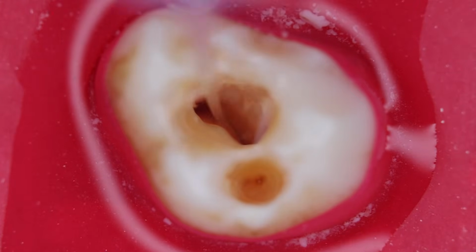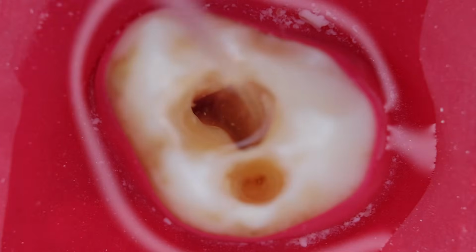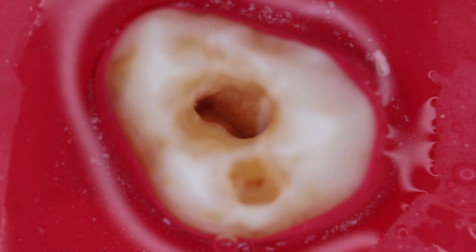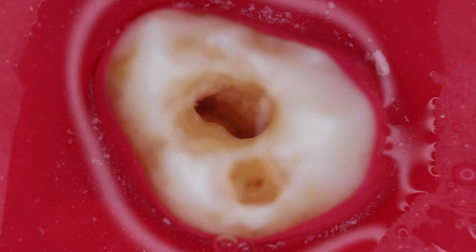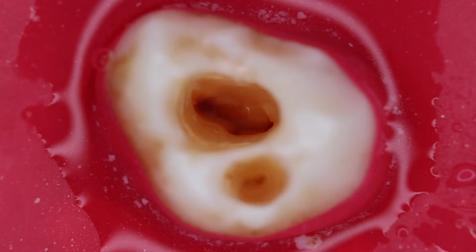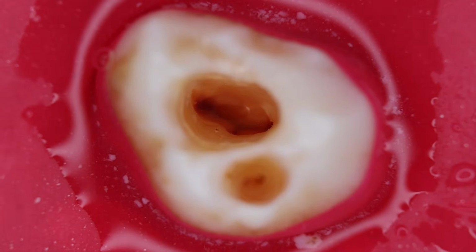If we have the option of a microscope, then we don't need to enlarge orifices, and we don't need to open this much wider access. We can keep our preparation conservative. Irrigate it till you get clear visibility. So once done, hope you are able to visually see how clearly the canal orifices are seen, and this is the time you can appreciate the canal openings as they are being demarcated.